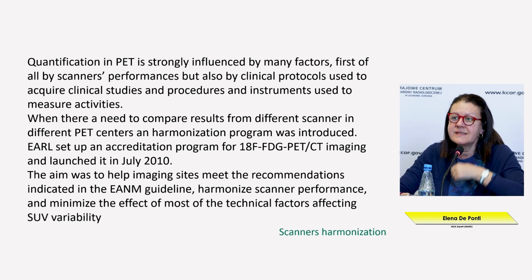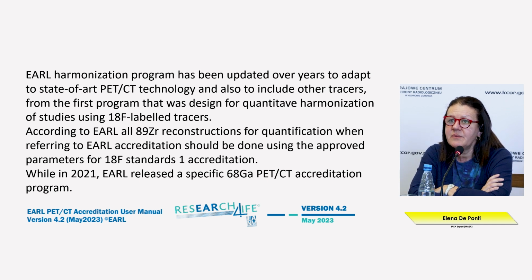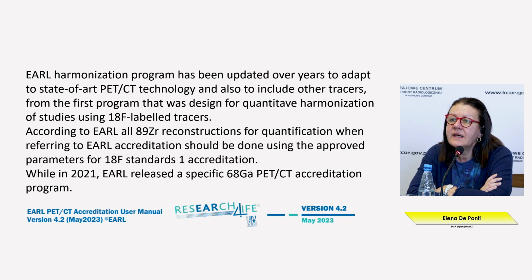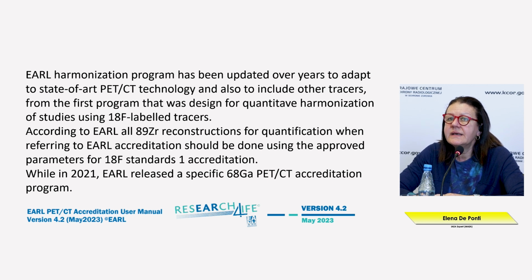So we need a scanner harmonization program, that is the EARL harmonization program provided by the group EARL of the Nuclear Medicine European Association, and they provide a way to evaluate the performances of our scanners and to establish which are the parameters and the correct protocols that could be used in clinical applications.